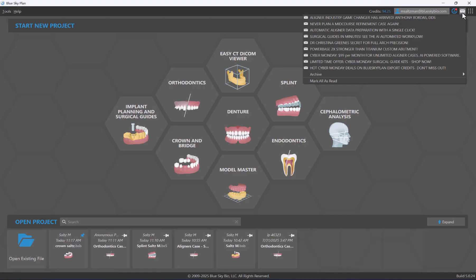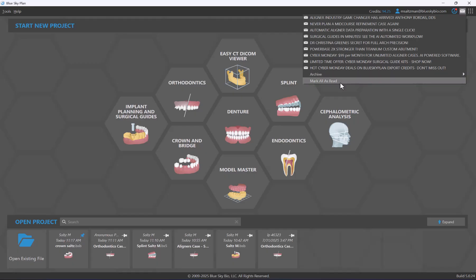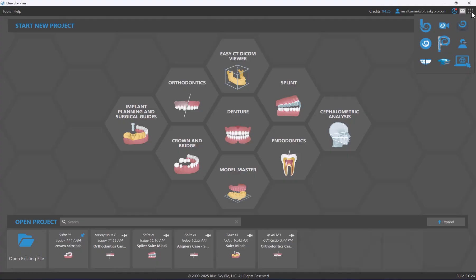To the right of that we have a message icon that shows recent messages from Blue Sky Bio. These messages might include new tutorial videos, new features and functionality, discounts, or promotions. Simply click on a recent message to see a particular video or open a relevant web page. You can use mark all as read to clear messages, or the archive option to see older messages.